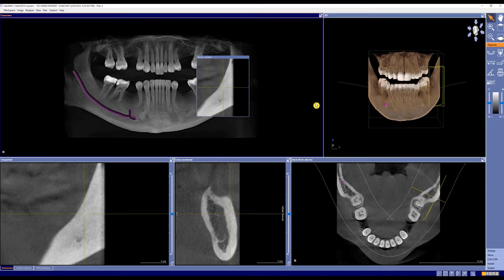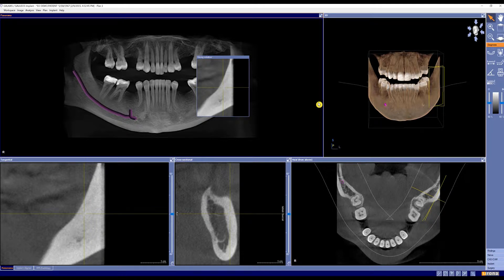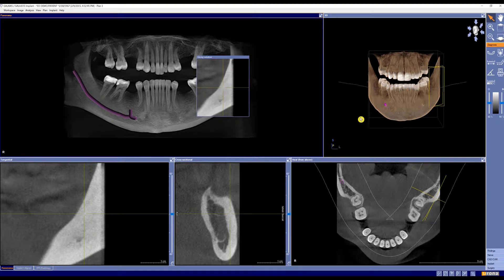Now let's go through an implant process when we plan from the crown down. This is a unique workflow from Dentsply Sirona, and to do so, we'll need to pull in an SSI file from your CEREC Acquisition Unit. Let's start by going to the right side toolbar and down to CAD CAM.